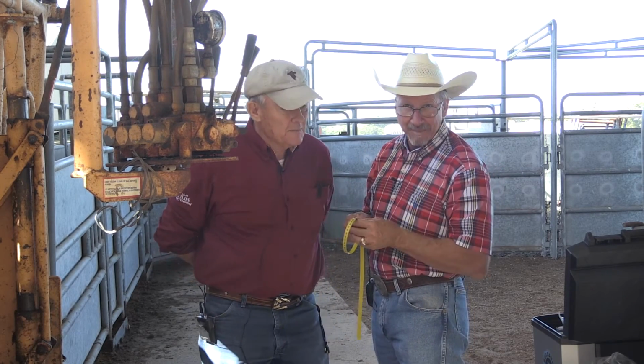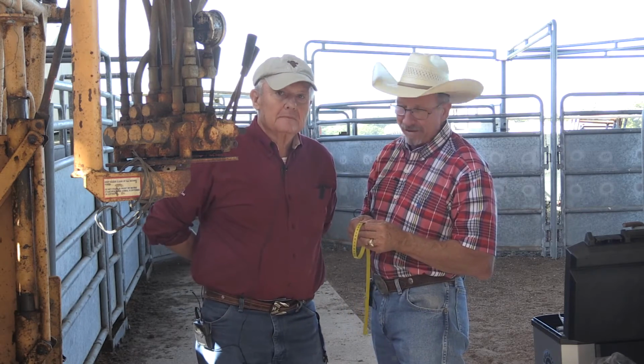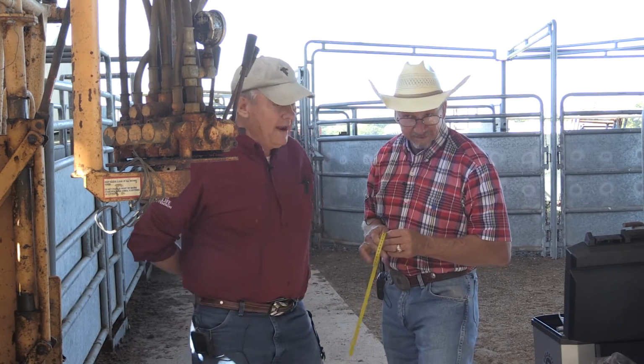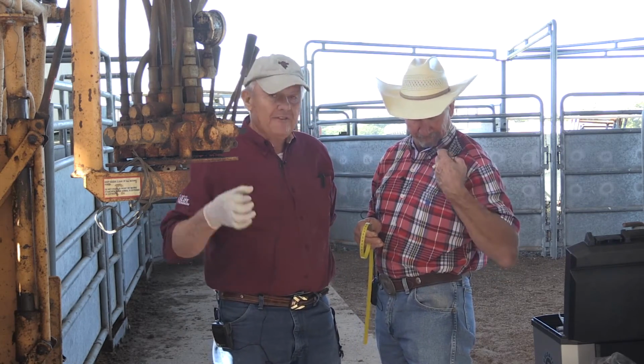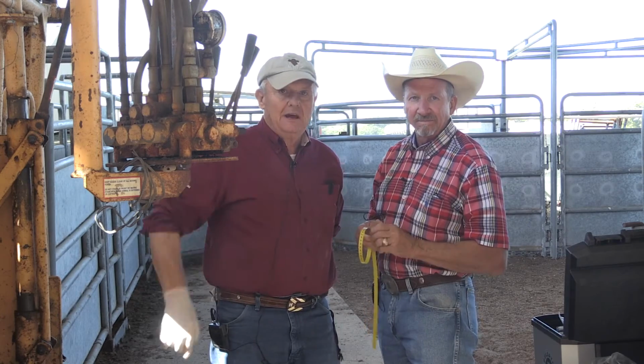So it's okay to look at them out in the pasture, but you really need to get them in and measure them correctly. And on a cold morning, testing bulls, again, you're going to have a little bit different factor because those testicles are not going to come down as good.